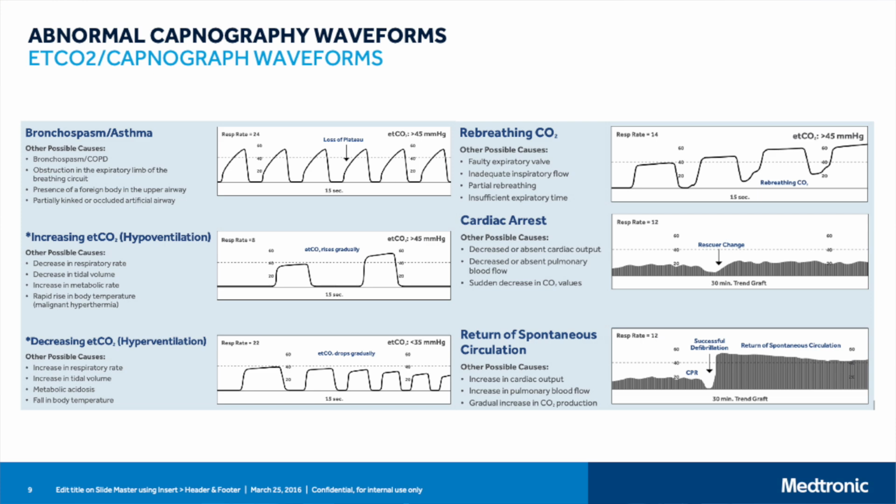If you look at your waveform and you see a shark fin pattern, it could be a bronchospasm, or it could mean your patient needs to be suctioned. It just means that the breathing pattern is being obstructed by something. If there are fewer and fewer waveforms, and you're seeing large seconds go by between breaths, probably what's happening is your patient's respiratory rate is dropping, they're losing that drive, and you'll start to see a stair-step pattern going up of CO2 value rising and rising.